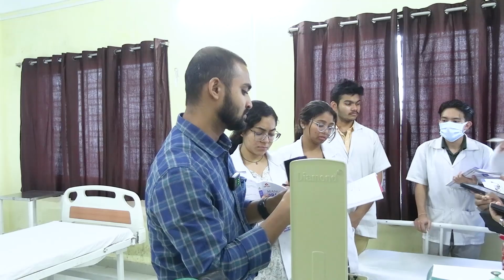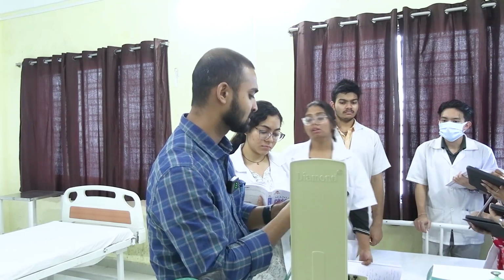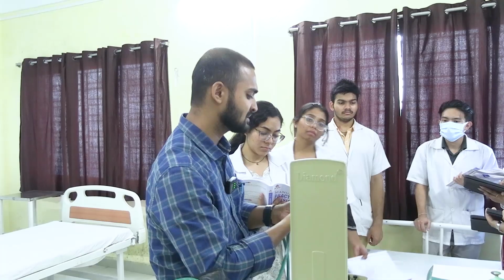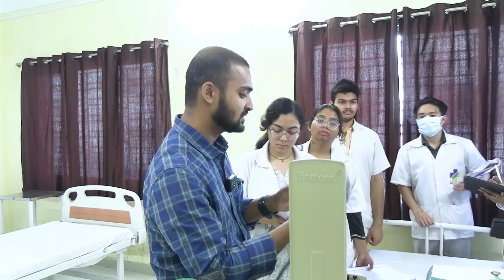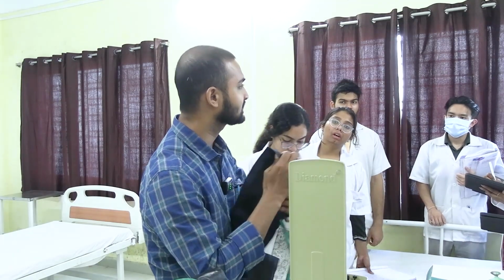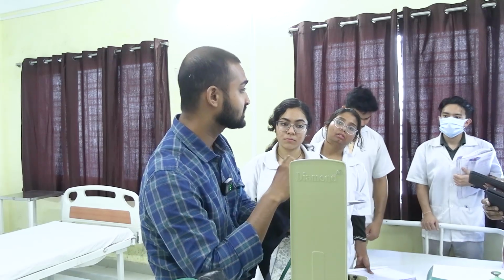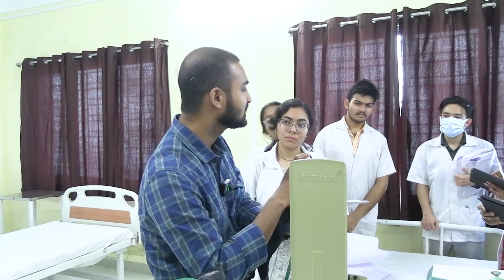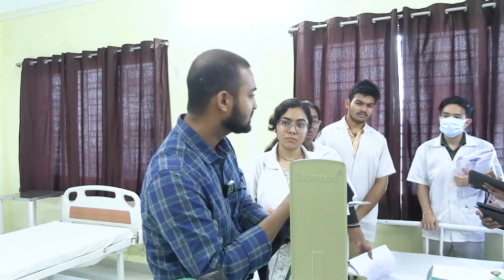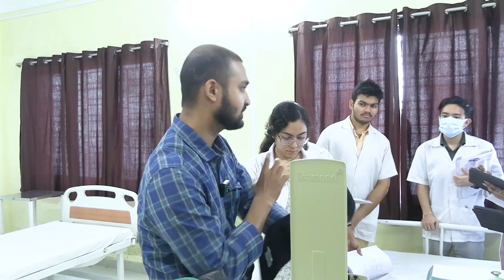So one is peripheral resistance or tissue resistance. To overcome this tissue resistance, some modifications have been done in the cuff. The cuff must be covering the arm circumference, and it must be 20% wider than the arm circumference. And the length, it must be more than how much? 2/3. It must be at least 2/3 of the arm circumference.